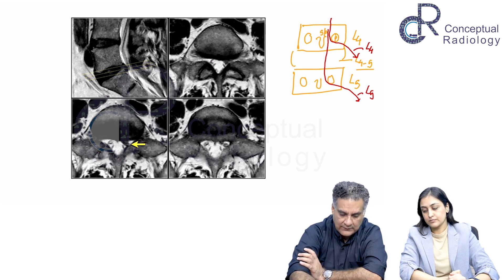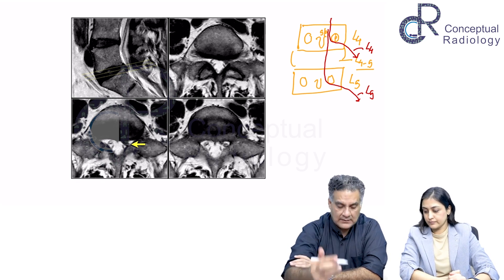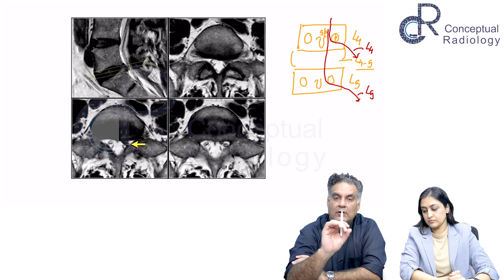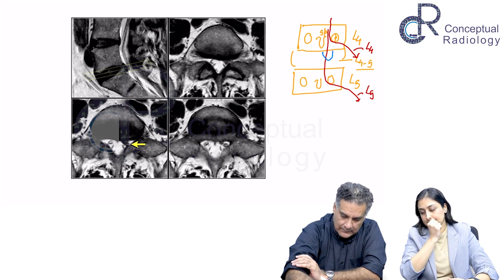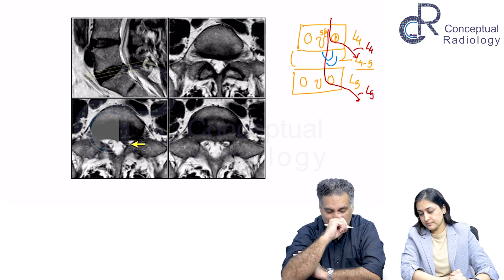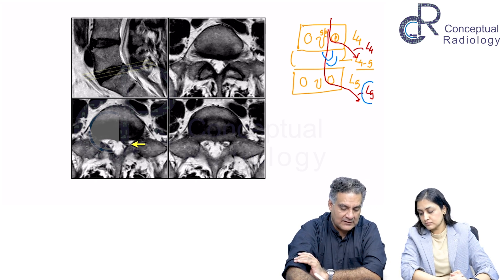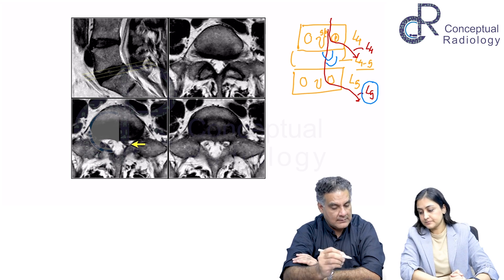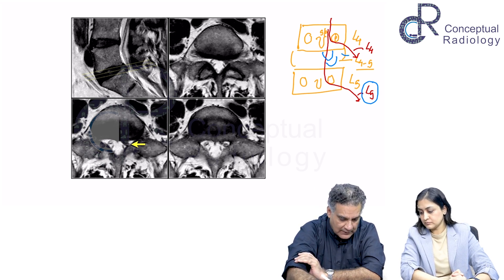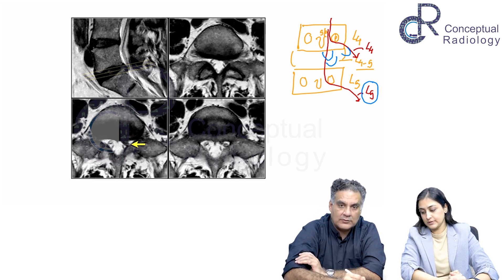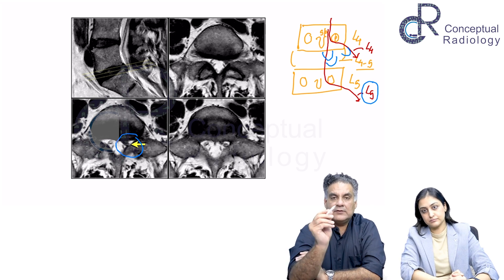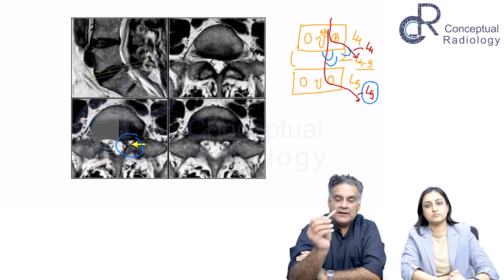The majority of disc prolapses are posterolateral, or rarely foraminal or far lateral. If the disc prolapse occurs at that posterolateral area, it is going to compress the L5 nerve root, because that is the nerve root which is traveling — it is the traversing nerve root. However, if it is a foraminal or far lateral disc prolapse, then it can compress the exiting nerve root at the same level. A radiologist drawing an arrow in the image is telling you which nerve root is getting compressed.